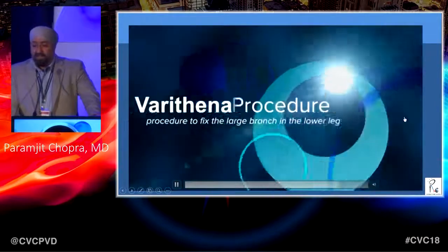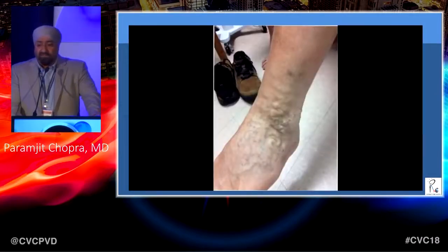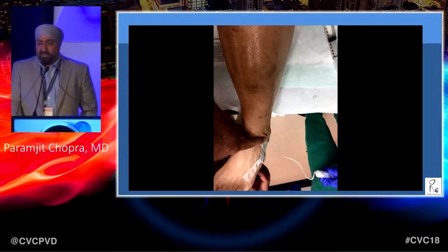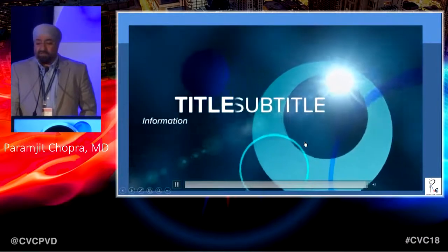I make sure that they have good compression. First 48 hours, don't take it out. I tell them have a shower with it, take a hair dryer, dry it if you want to. Then after that, they can wear it mainly when they're vertical. The reason I say that, I had a guy who used to work the night shift. So I told him, wear in the day, don't work at night. So he was sleeping all day and he wore compression. He was standing all night and he didn't wear any compression. So since then, I've kind of said that. Again, this was the last one where we got into that branch that was lower down and finished that.